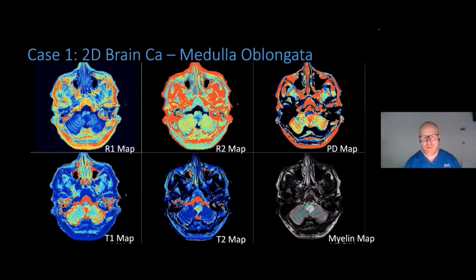You can go and put little ROIs and do little measurements of any part of that tumour separately. But if you're looking at the size of a tumour or the restriction or all of the things that we normally see with tumours, the best we're really going to see going forward is it globally getting larger or smaller. By looking at the substructure of a tumour, you can actually see a lot more change in real time as you see progress of this patient. This is a very powerful tool.